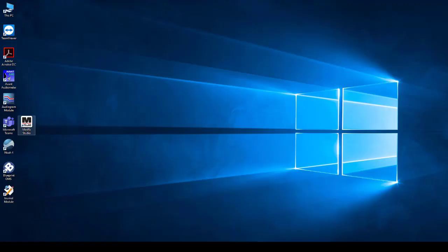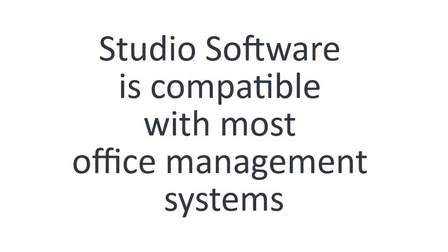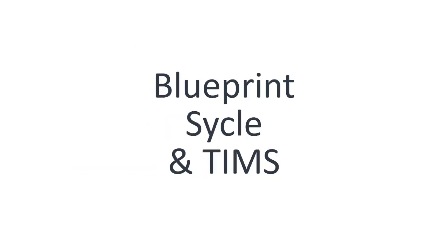The Studio software can be run standalone or from within the Noah system. It is compatible with most office management software systems including Blueprint, Sycle, and TIMS.